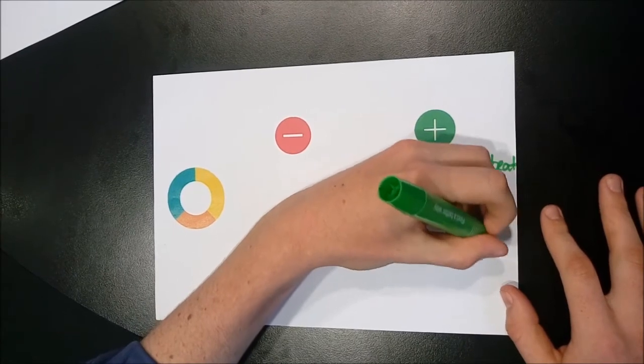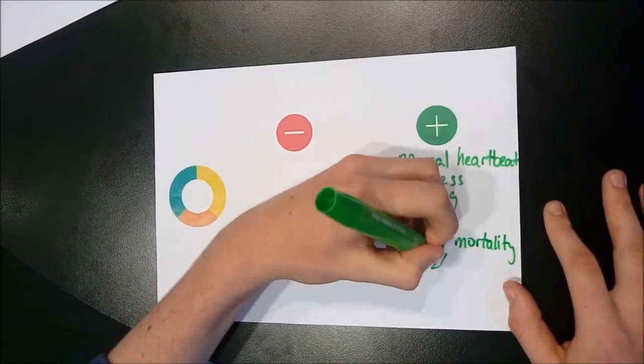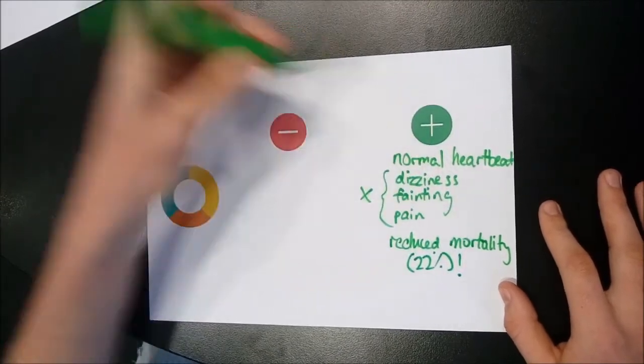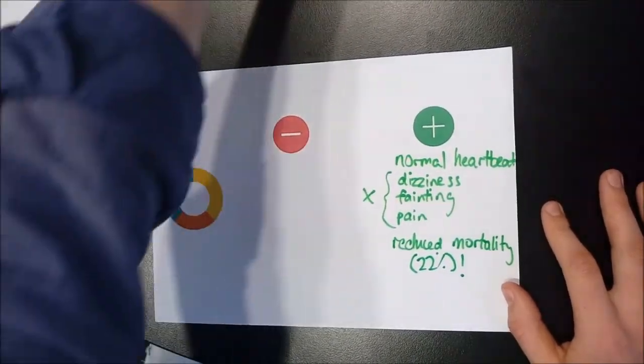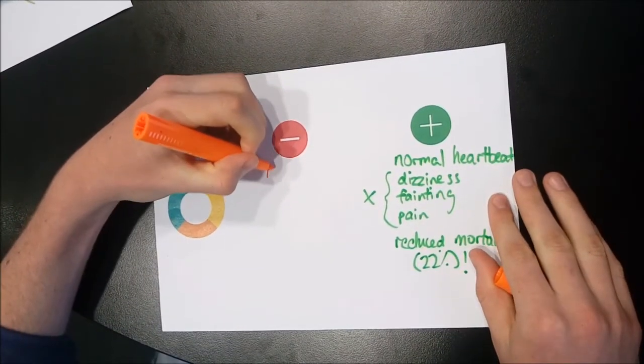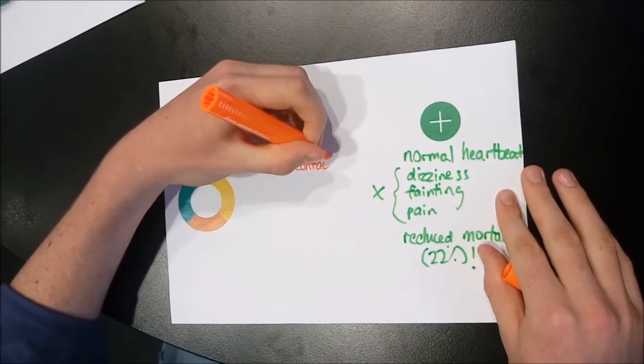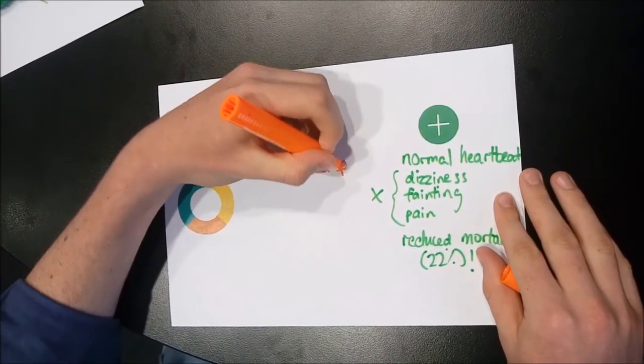In terms of the pacemaker's limitations, these are fairly minimal. However, there are still aspects that warrant discussion. Firstly, whilst pacemakers are fairly robust and highly portable, playing contact sports isn't recommended, as it can risk damaging the pacemaker, or it can cause the implanted wires to shift and detach. Both of these outcomes can endanger the patient's life.